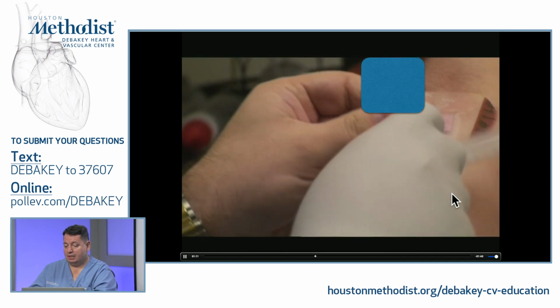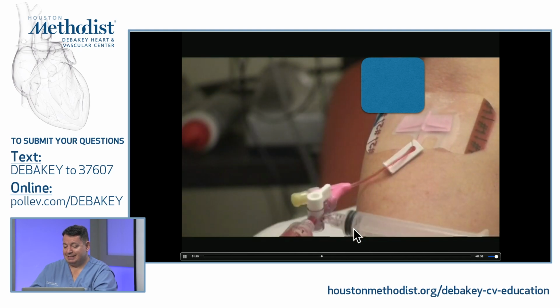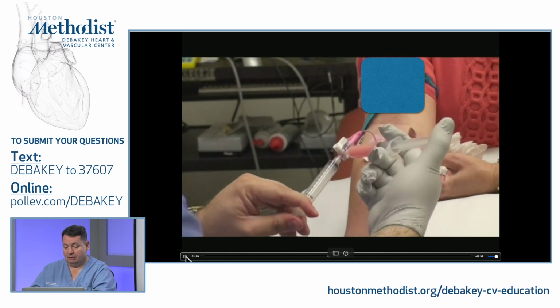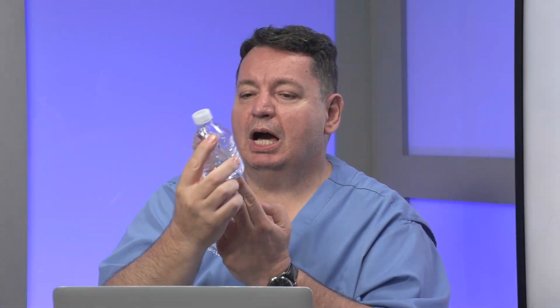And this is where you see the flush, and immediately it makes my saline a little bit pinky. And one of the other ideas that I want you to watch: I'm agitating about 10 times, again, just on the physics. So here's my bottles. The bubble always goes to the surface. So if I'm injecting downwards, my bubble is going to stay last. So this is why it's very important that my injection needs to point upwards.